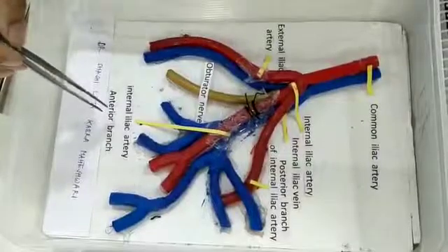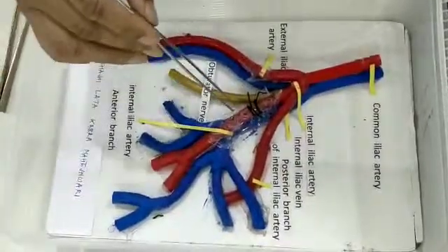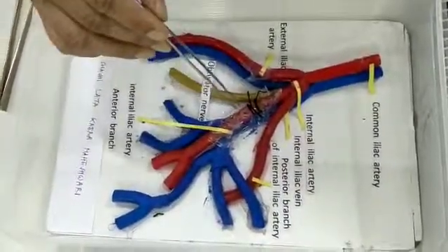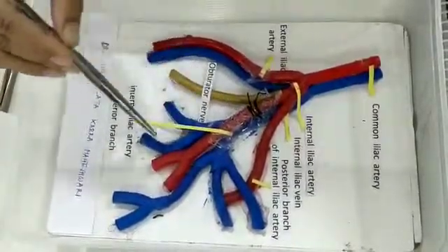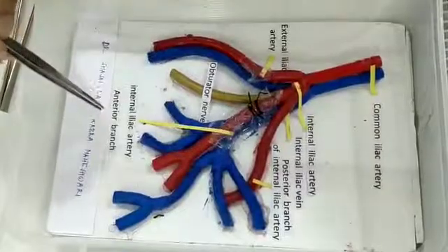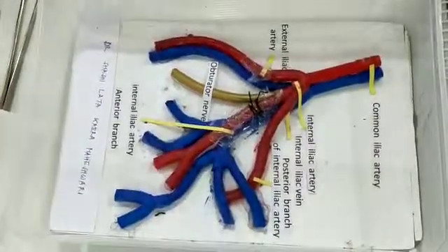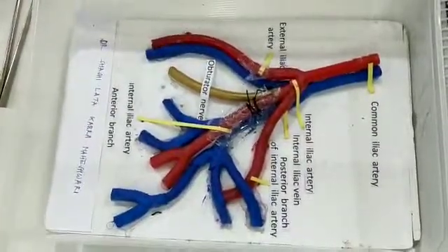This is the anterior branch of the internal iliac artery, which is the portion where we apply the ligation on the internal iliac artery.